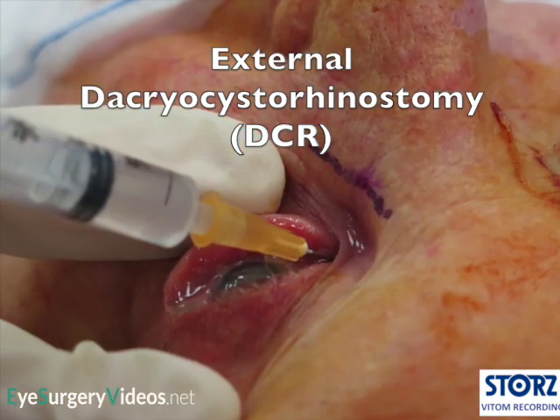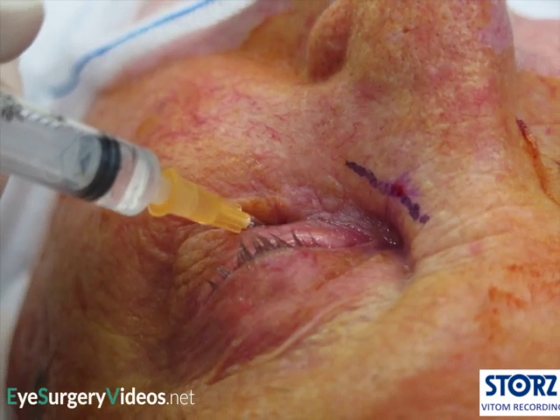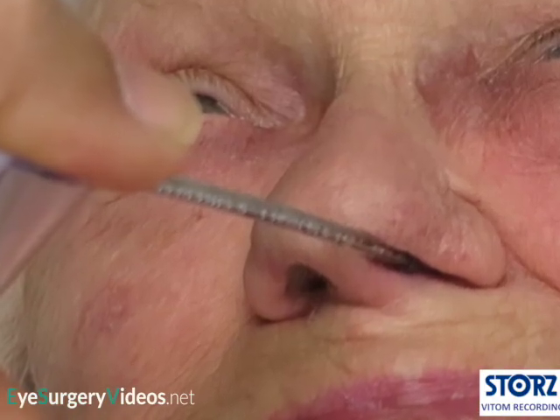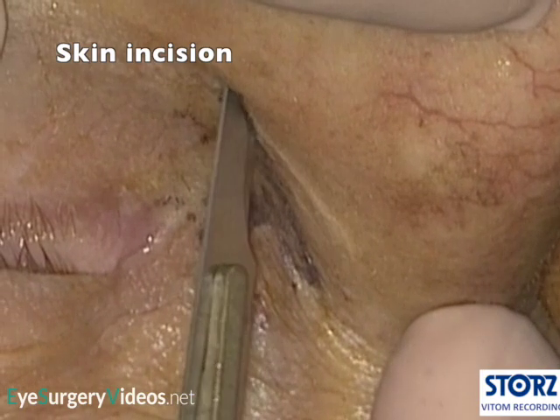This patient is under general anesthetic and has had local anesthetic with adrenaline infiltration and preparation of the nasal cavity with co-phenylcaine spray and ribbon gauze with cocaine 5% paste. External DCR can also be performed under local anesthetic, generally with some degree of sedation.